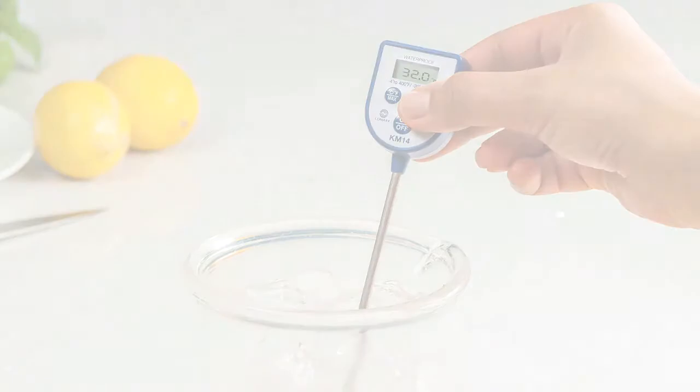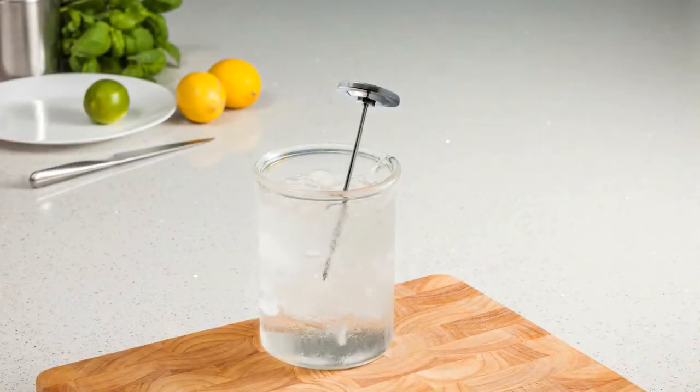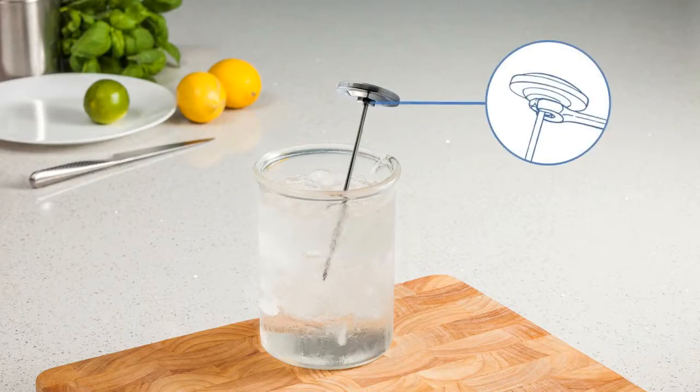To begin the calibration on pocket dial thermometers that have an integrated calibration nut, simply immerse the probe to the depth marker and then manually adjust the calibration nut until the pointer on the dial reads 0 degrees Celsius or 32 degrees Fahrenheit.